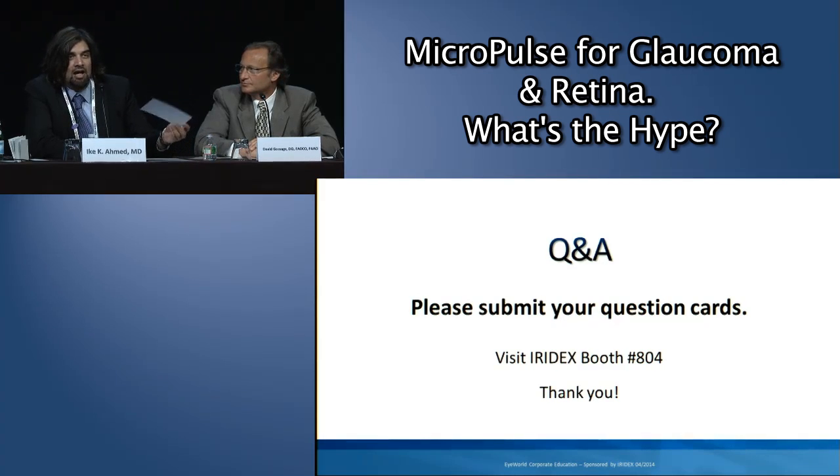Someone asked about doing a PI. You certainly could, like you would with an argon laser. I typically use a YAG, but you could use this platform to do initial thinning of the iris, chipping away at it for a thick brown iris as well. You typically see a result often literally in a few hours, but usually you wait 1 to 3 months before getting a full response. I agree with David that even if you don't get a response at 1 month, we sometimes see a few percentage of patients that will show a response at 3 months. And that's typically what we do.